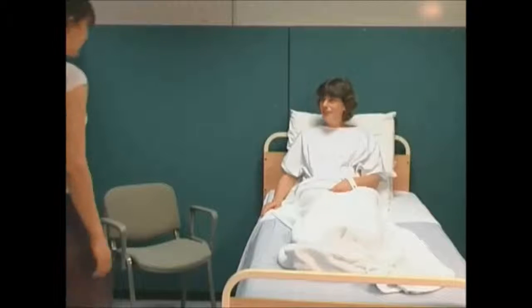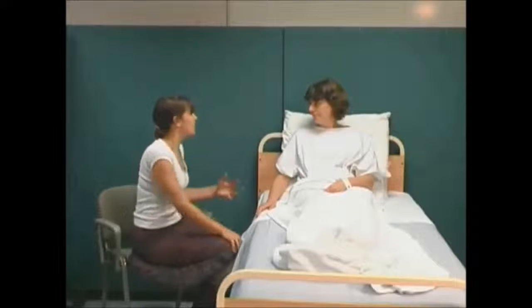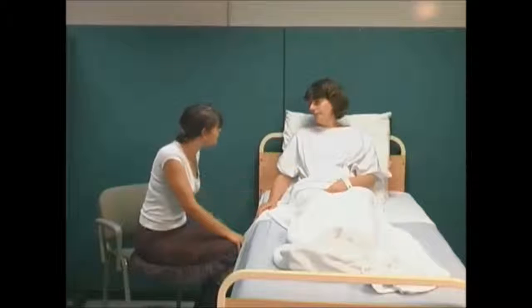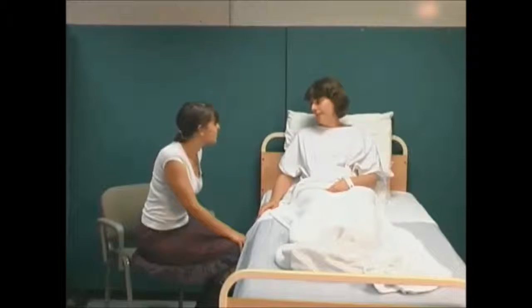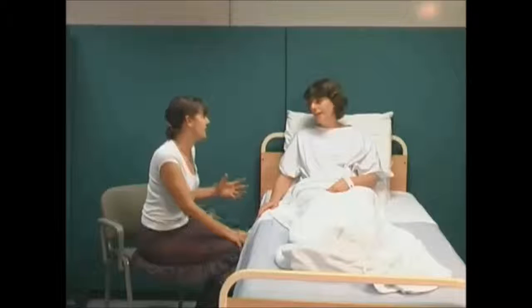Hello, Alice Winter. That's right. Hello. Yes. Hi, my name's Claude. I've been asked by one of the nurses to come and talk to you about the need to have a cannula in so that we can give you some IV antibiotics. Has anyone come to speak to you about it? Yes, they have. So you understand why you need a cannula? That's right. And are you happy to have a cannula? That's fine, yes.